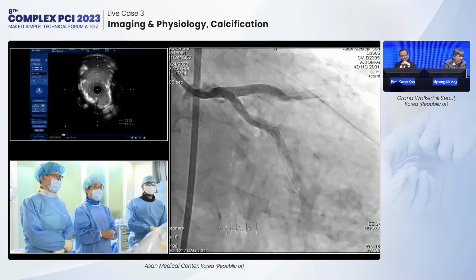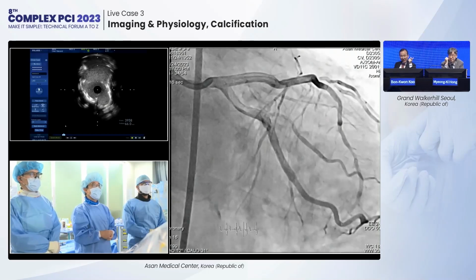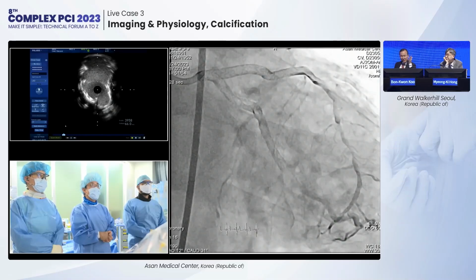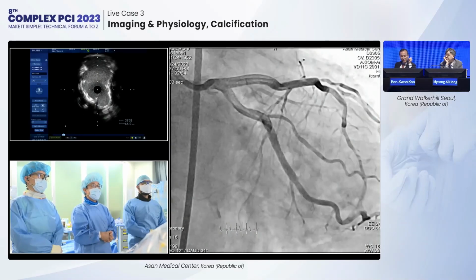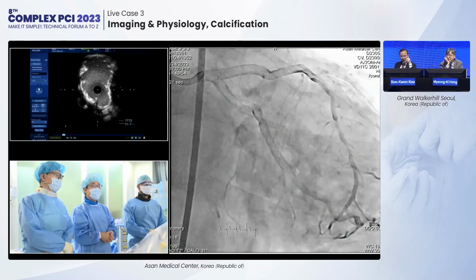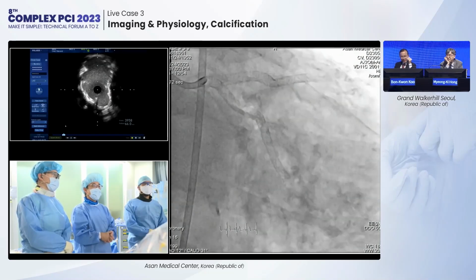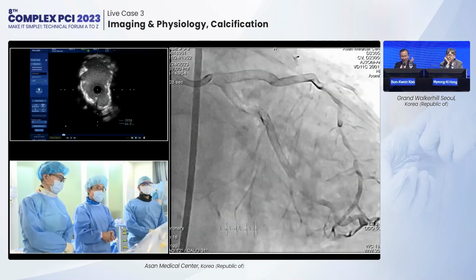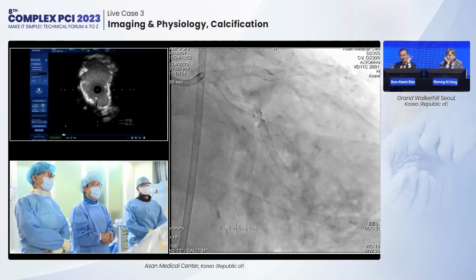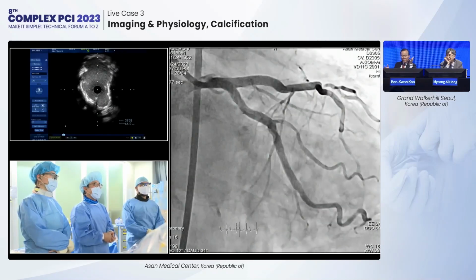So, Dr. Bach, I would say congratulations. But in comparison with the previous Nanjing live demonstration, the same left main, it is interesting that your procedure seems to be much simpler, because Professor Xiaolong Chen did lots of DK crush and lots of POT procedures, but you did a kind of minimal crush and then finished kissing balloon inflation without POT. So do you think that kind of difference in approach makes a difference in outcome, or because you have a perfect result by the IVUS, it will be fine?